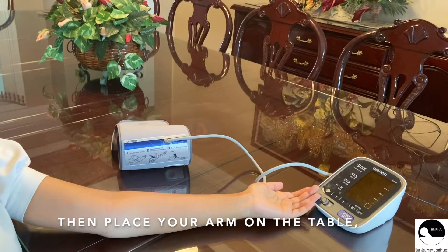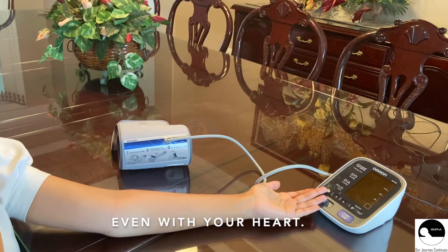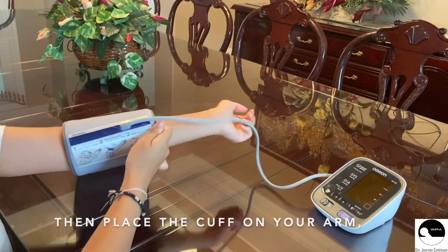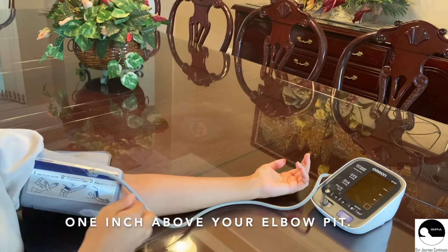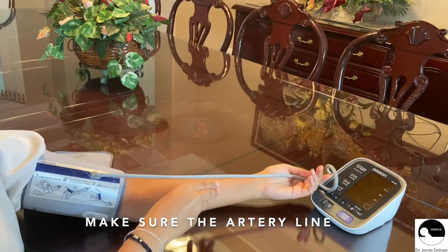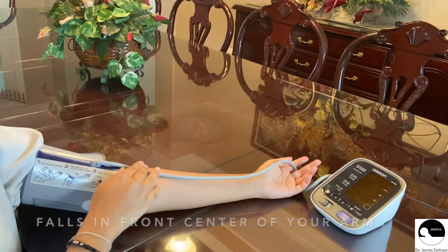Then place your arm on the table, palm upward, even with your heart. Then place the cuff on your arm one inch above your elbow pit. Make sure the artery line or the tube falls in front center of your arm.